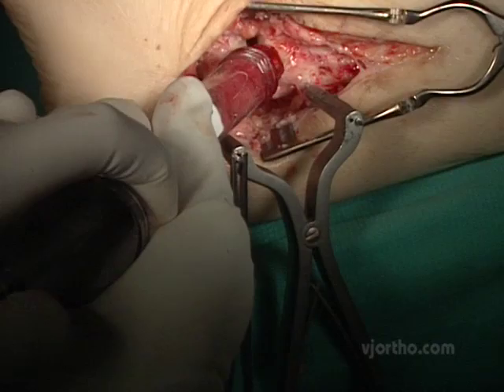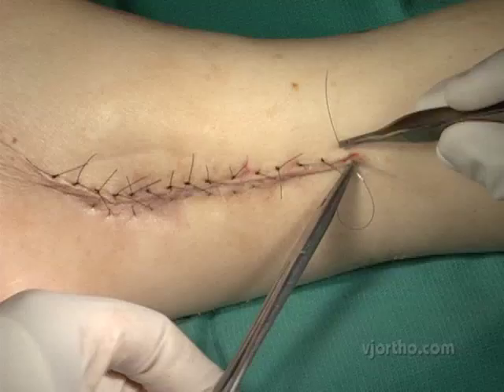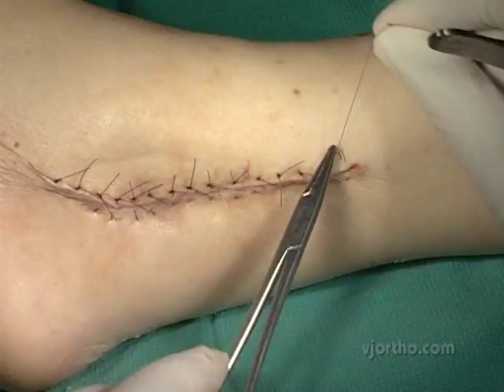Here is the bone graft and you can see it's been worked into a nice paste. Despite the previous surgery, I really think that this closed up well. Despite having corrected the hindfoot alignment slightly — which would put a little more tension on this wound — it's a longitudinal incision so the effect is not great.